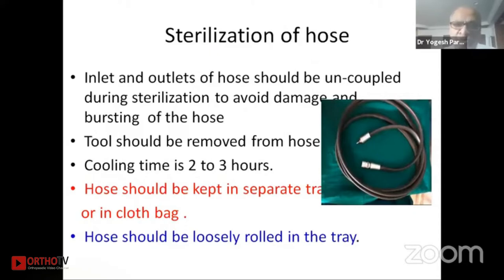A special mention about the sterilization of the hose: the inlets and outlets of the hose should be uncoupled during sterilization to avoid damage and bursting of the hose. Otherwise, the air inside the hose will expand and the hose can burst. The tool should also be removed from the hose — no drill machine or saw should be attached while sterilizing.